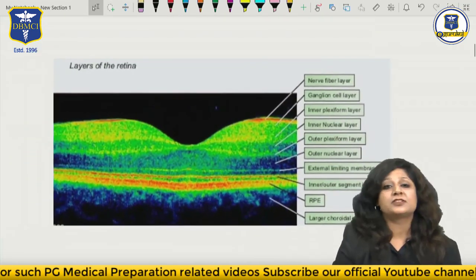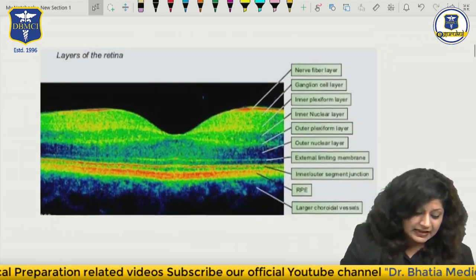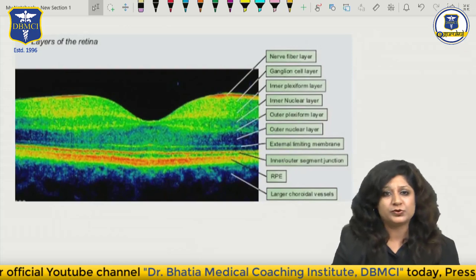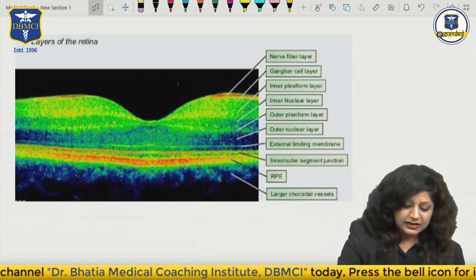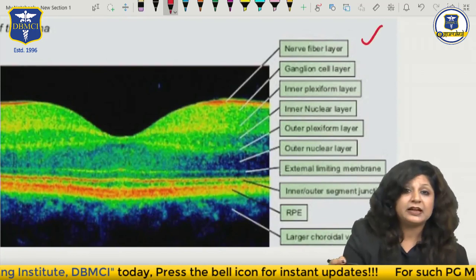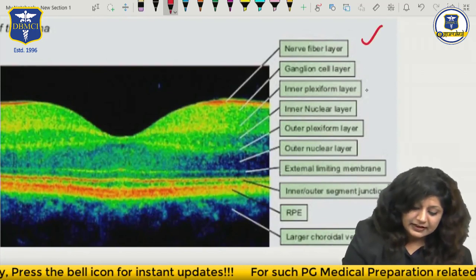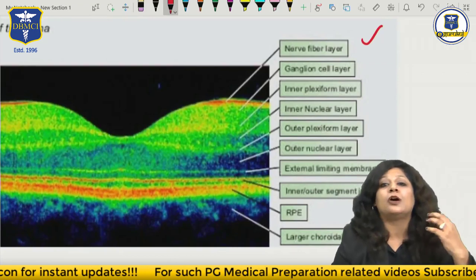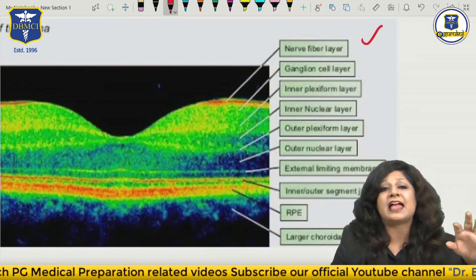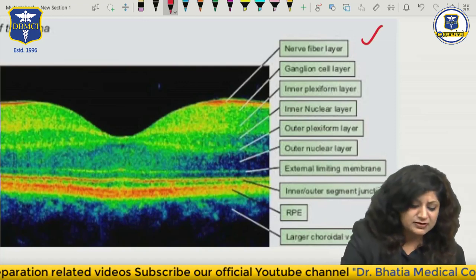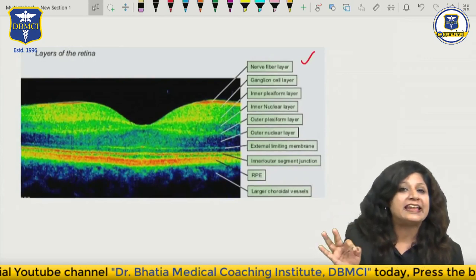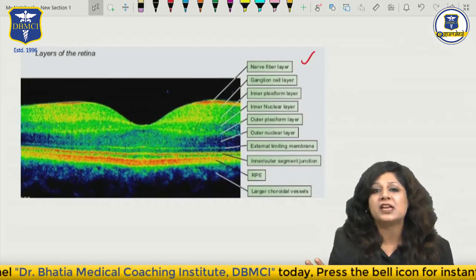Can you see this black area? This is the subretinal space having the subretinal fluid. Now we know how to read this OCT. This is just to show you that we can actually delineate all 10 layers on the OCT - the nerve fiber layer, ganglionic cell layer, inner plexiform, inner nuclear, outer plexiform, outer nuclear and all the layers. This is a beautiful picture of a normal retina showing all 10 layers on the OCT.